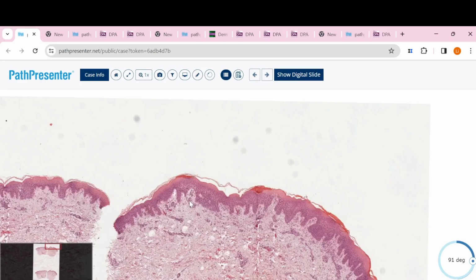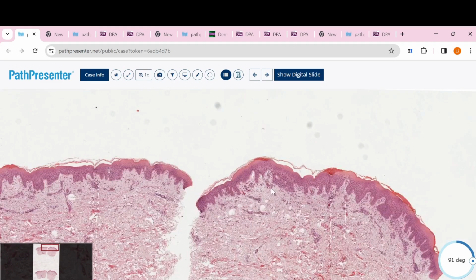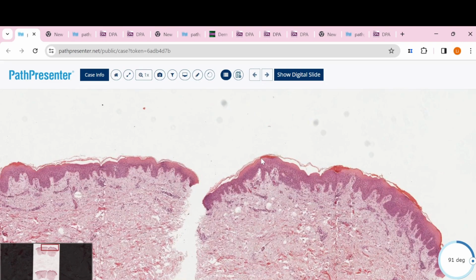But the first thing you need to remember is this mounded parakeratosis, because for this whole chapter, I don't even think of any other diagnosis that has this mound. Oh, maybe there is one. When we get to that, I will also tell you which one. I put one case of that diagnosis. Any questions about this one?